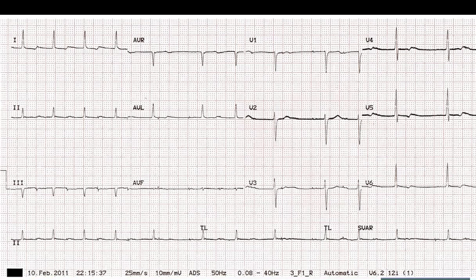I don't know what TL is, I just ignore the abbreviation. Okay, then there is also atrial pacing followed by a native QRS, then followed also by a fast atrium with prolonged AV conduction.